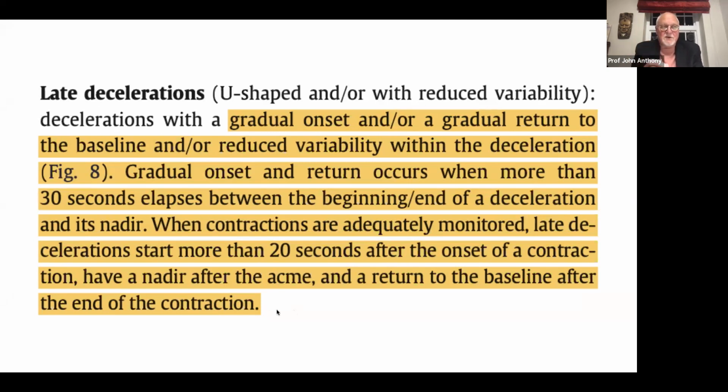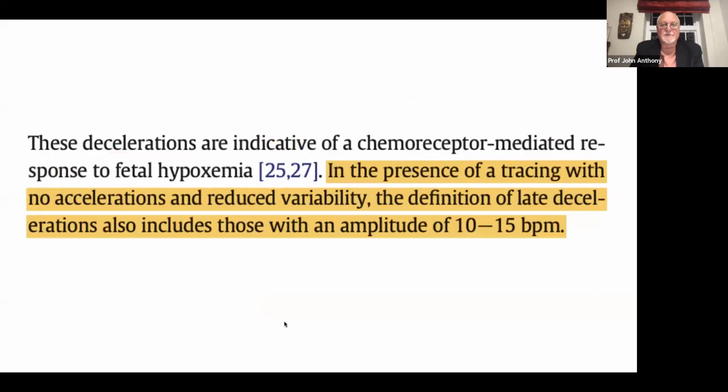So there's a description here of what a late deceleration is. And I repeat, we are so much inclined to walk past a tracing, look at it, eyeball the decelerations, and have an intuitive feeling of what they represent without actually stopping and applying these criteria deliberately and carefully to decide whether or not the decelerations are significant.